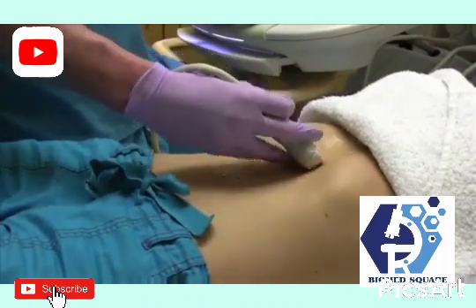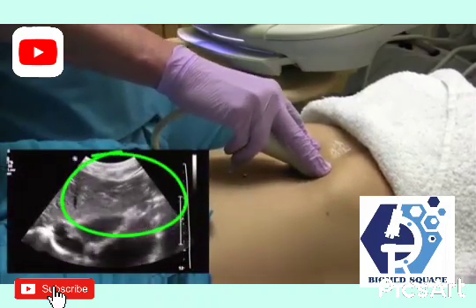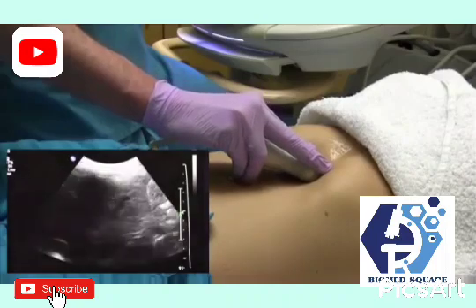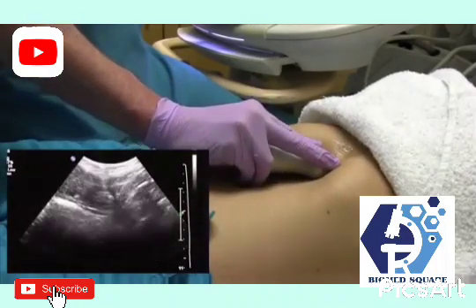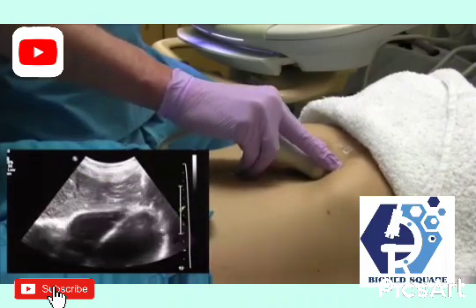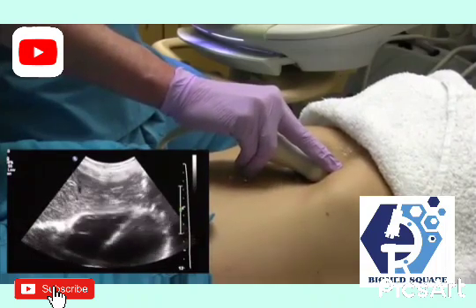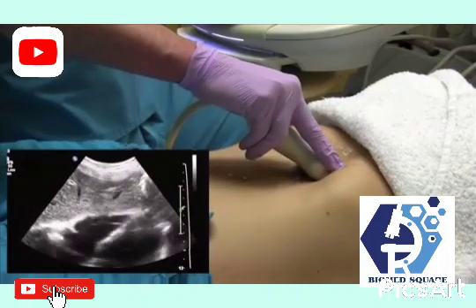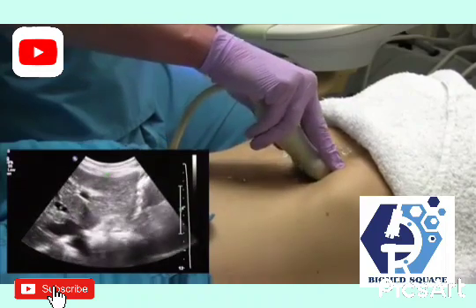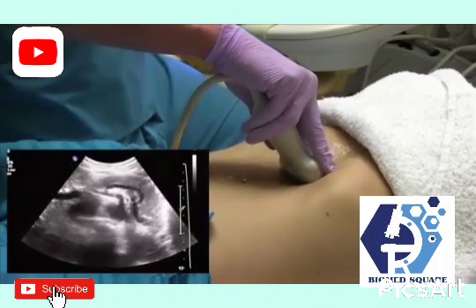Next we go to transverse, and for that we're going to start again with the left lobe, subxiphoid, and you kind of grab the top of the probe here, and you want to make sure you sweep all the way up through the left lobe till you see the heart. And then as you come down, very similar protocol, you start at the top of the left lobe with the parenchyma. Coming down, you'll see the hepatic veins. And then last, you're going to see the portal veins. And you sweep all the way out of the left lobe here.